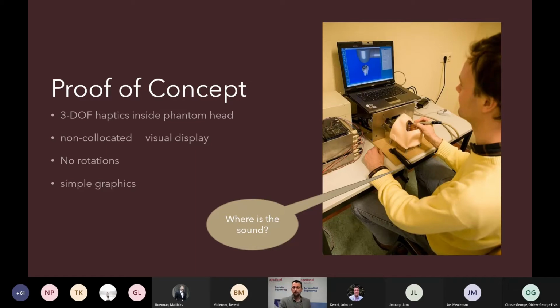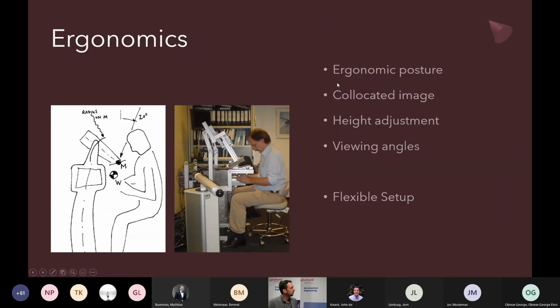The pitch of the burr drops when you push too hard, and so they pay attention to the sound of the drill. So apparently, force feedback, the sensing, also comes from sound. It makes sense if you think about it, because if you push too hard, then the RPM drops, and the dentist used that cue in combination with the real force feedback. So we had to develop the sound. I will not go into detail about that, but that was a development on its own. Apparently that was, in that stage, more important to convince the dentist of the concept of the simulator.